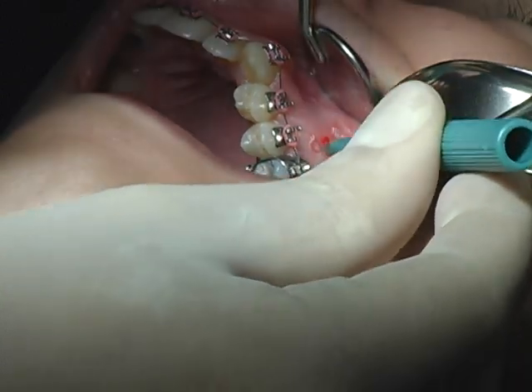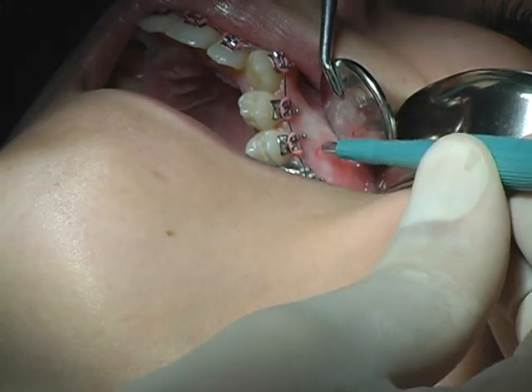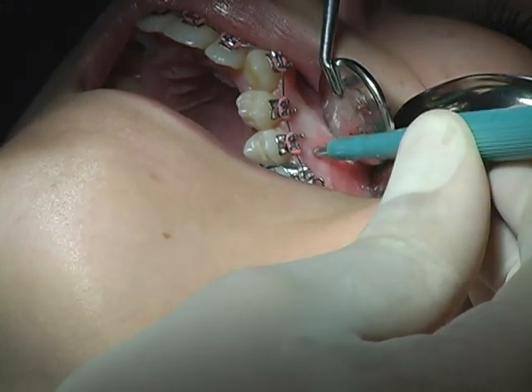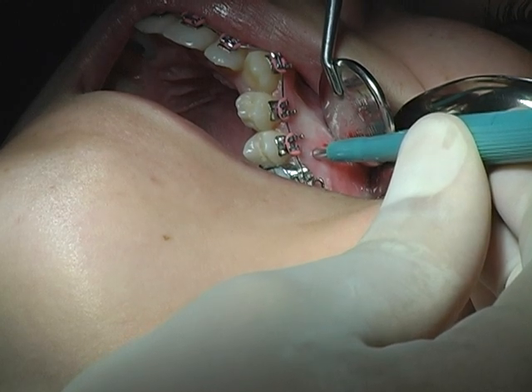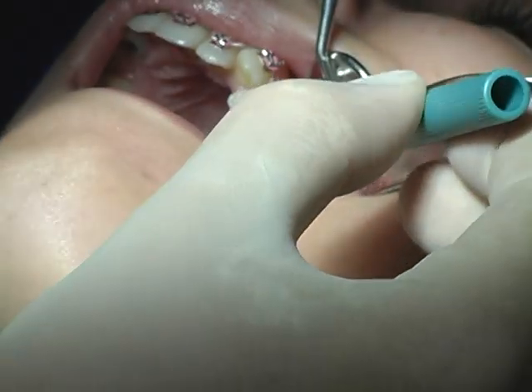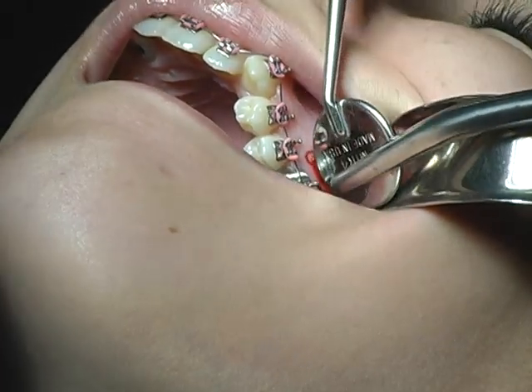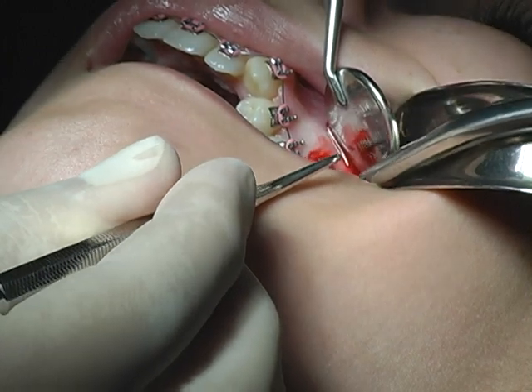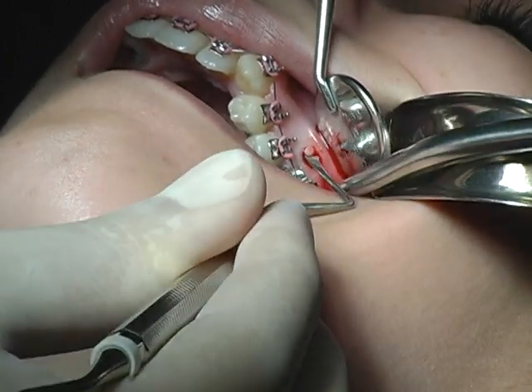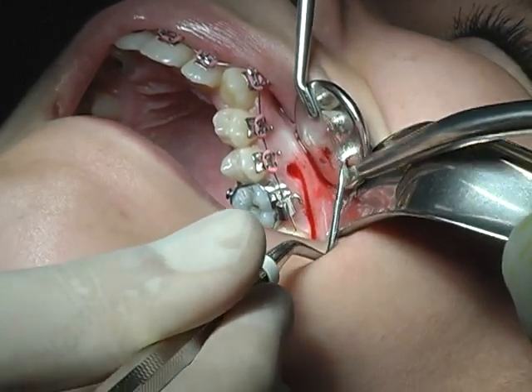I go back there exactly to the same spot. Stay away from the mucosa — it will be here. Any pain? Go down all the way, turn it two, three times. And that's it. Then I take my excavator and take this small piece of tissue out.